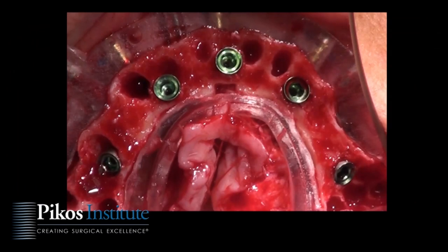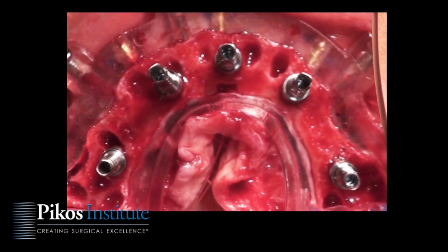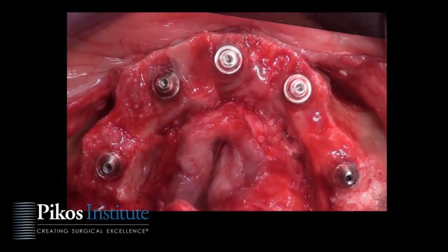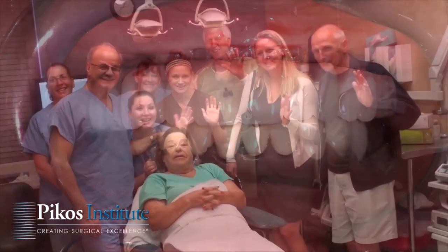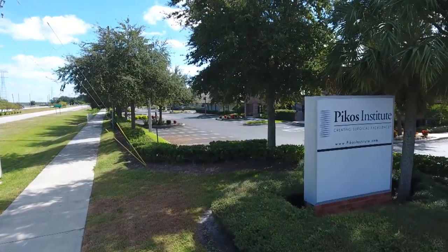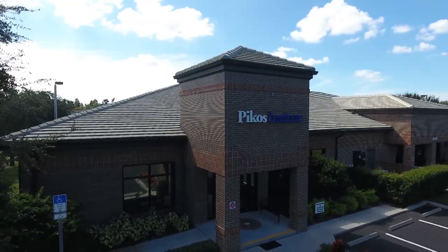But here in summary, we've extracted teeth, we've placed our implants with our foundation guide, multi-unit abutments in place, the copings, our gasket with our prosthesis, and in interim we will have grafted as I've shown you, and there's the provisional prosthesis in place, and a happy patient, to say the least. So again, we're transforming lives here at this Institute via this particular protocol that we've followed now for some 6 years.